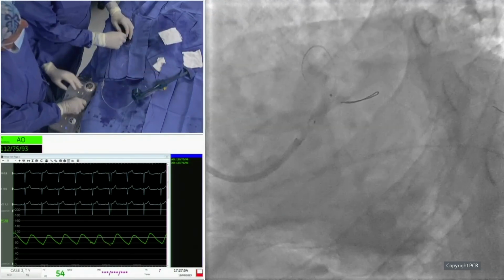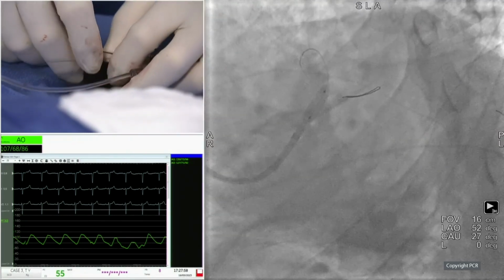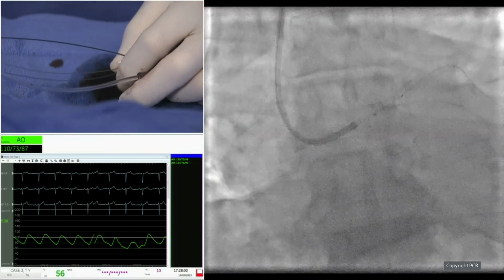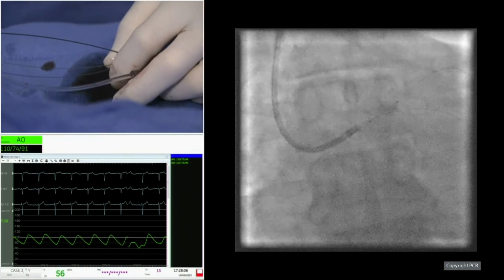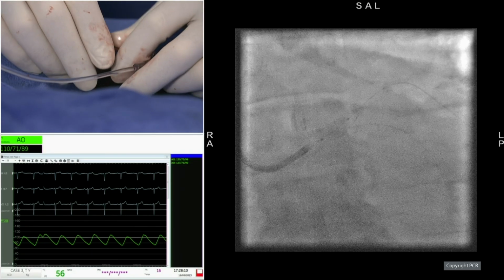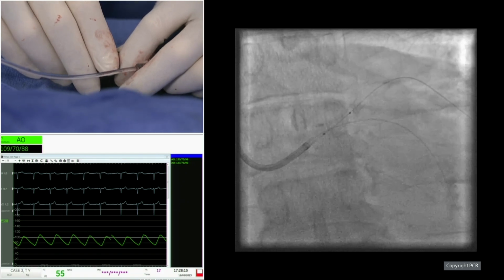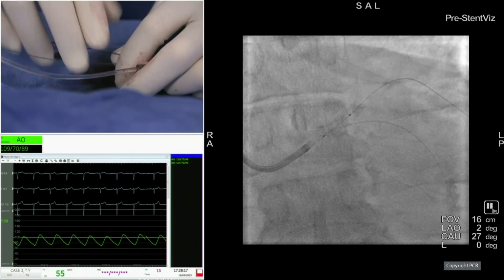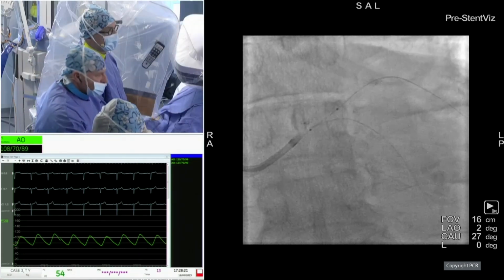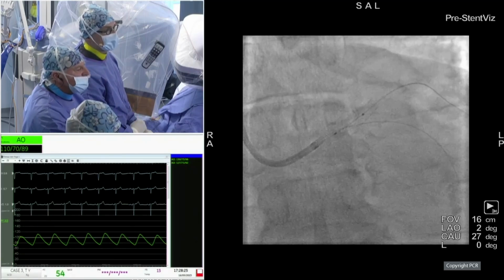That's really a critical moment in the procedure, because you can get engaged in the two-stent technique, not because you want, but because you have been provisional until now. And if you are forced to do something in that direction, there will be no argument, it will be done. But if it is acceptable, it depends very much on the type of flow, length of dissection, irregularity of the lesion. Absolutely.